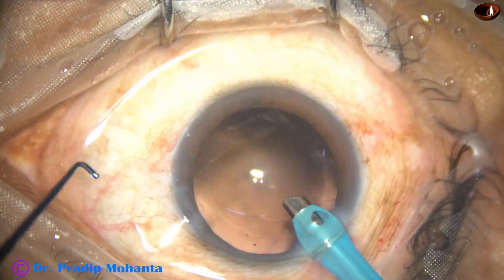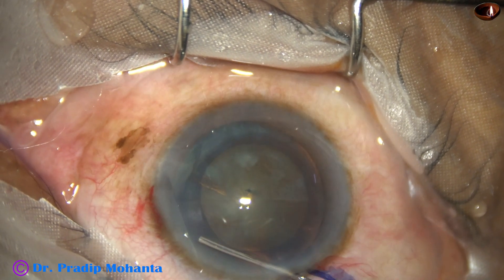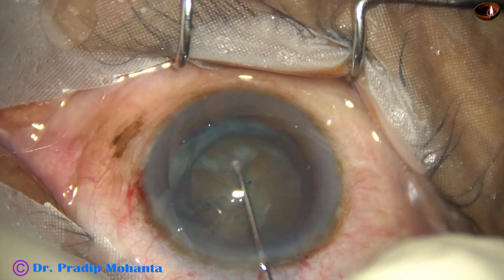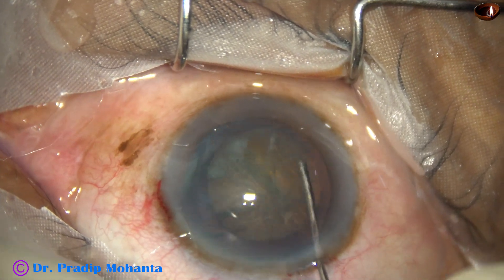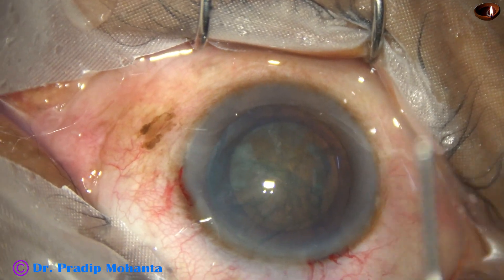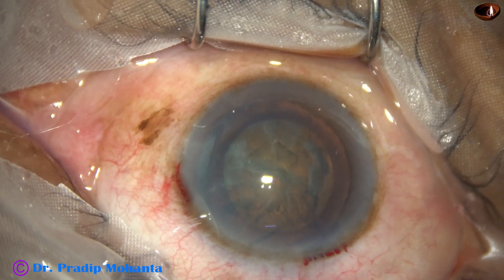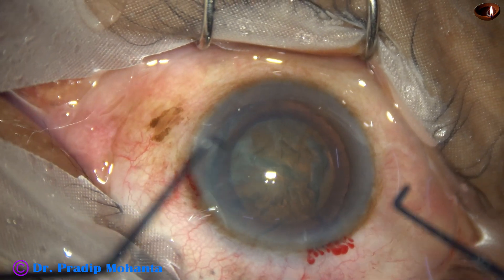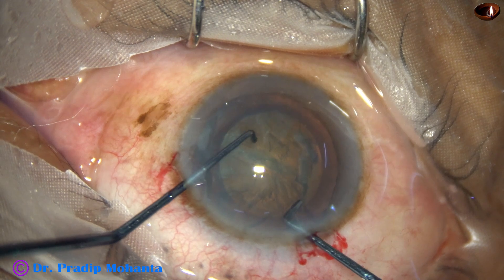And now the second video clip. Hydro-dissection is done, the nucleus is stabbed, the nucleus is rotated, the anterior chamber is filled up with visco — that is 2% HPMC. And now the pre-chopper and the sustainer are taken.